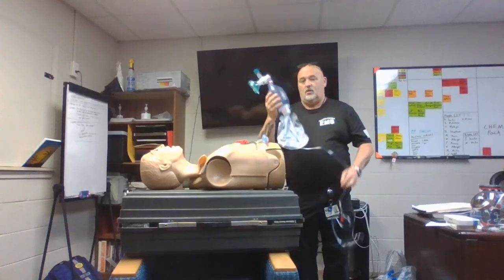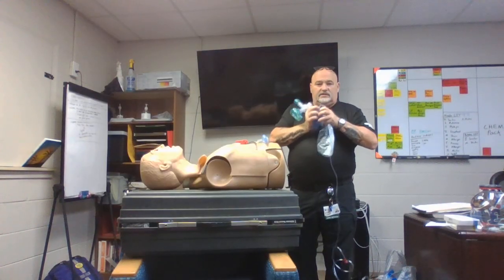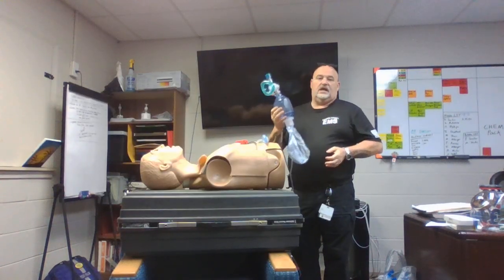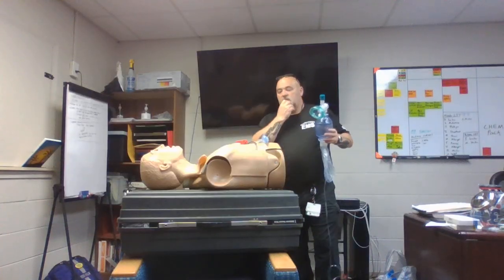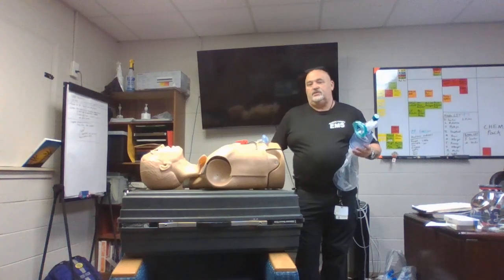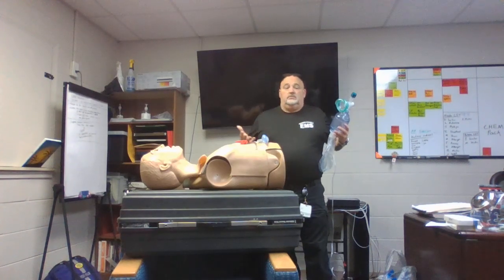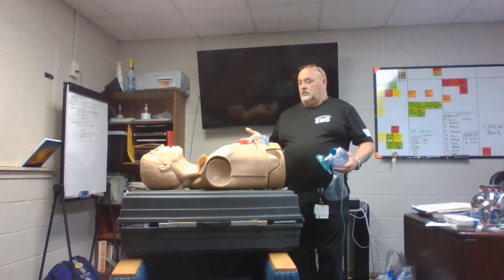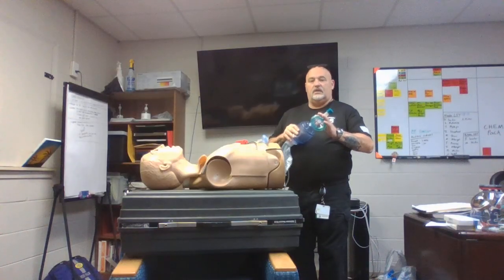And when we do that, how hard are we squeezing that bag? Are we crushing that bag every time we squeeze it? No. All we want to do is get the chest to rise and fall. That is all. Anything else, you're overinflating the lungs, you're causing distension. Depending on the patient, you could cause a lot of trauma in there. You could cause a pneumo. Not trying to, but you can. So we want to be careful. We just want that chest to rise and fall.